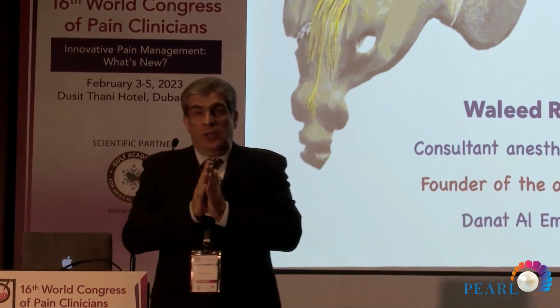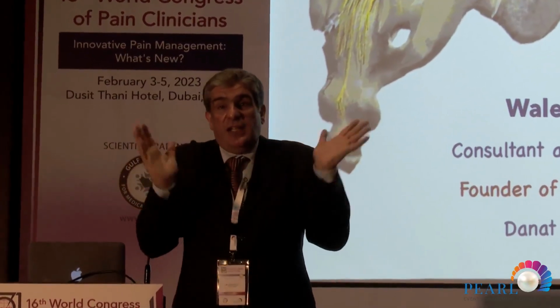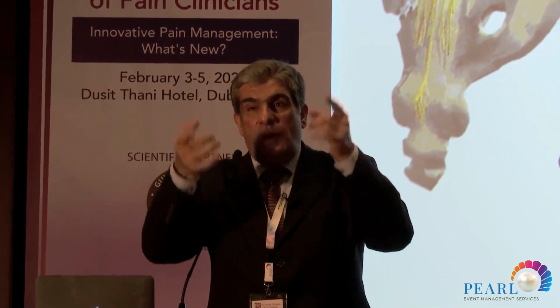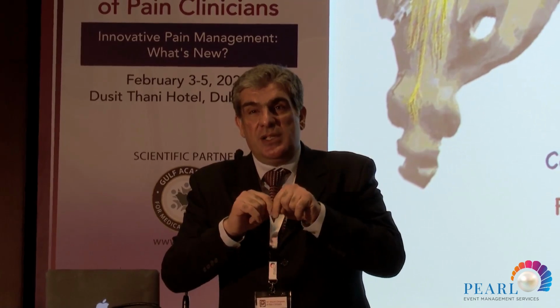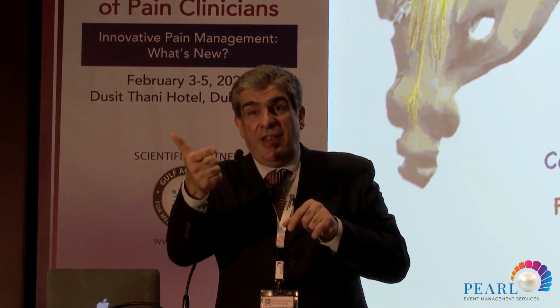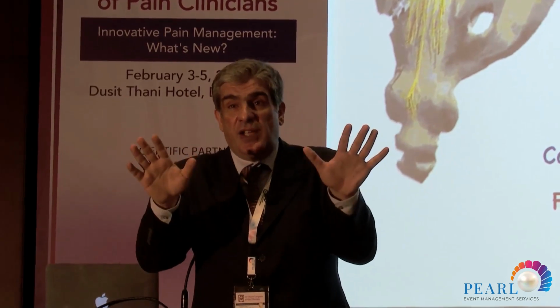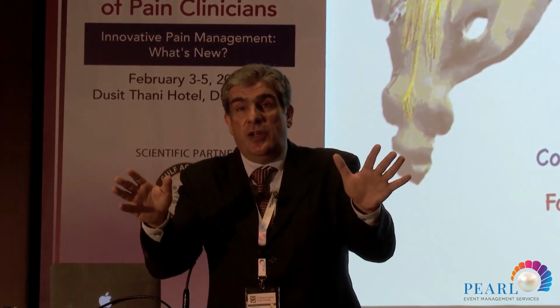As I told you, ultrasound technique is already validated. We do ultrasound foraminal injection. The only thing, once you are at the intertransverse ligament, you don't see what's going to happen. With this, you see. So definitely we have more safety because we're going to see the artery and the nerve. In fluoroscopy, we do inject dye and we're sure we're not intravascular, but we know nothing about the nerve.